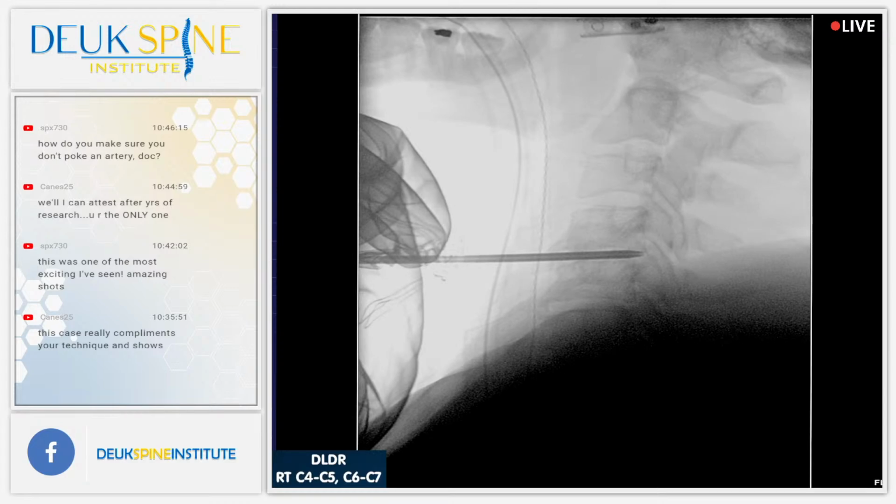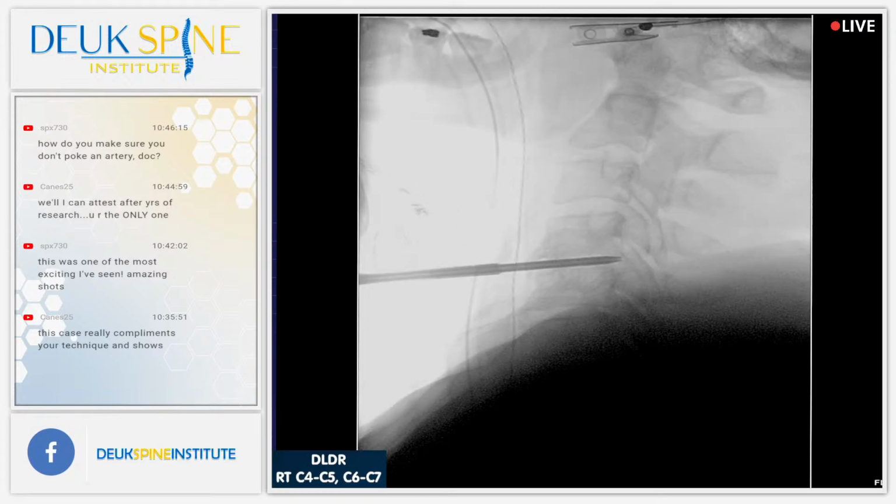So why is it important? I'm going to tell you guys a secret about fluoroscopy units. Fluoroscopy units are X-ray machines. They produce X-rays, and then they detect the X-rays. They pass the X-rays through a space between the emitter, or producer, and the detector, okay? The newest technology in fluoros is flat panels, and they've been around for about 10 years, maybe a little longer or shorter. Flat panel technology replaced the old detector technology, which was not nearly as good.